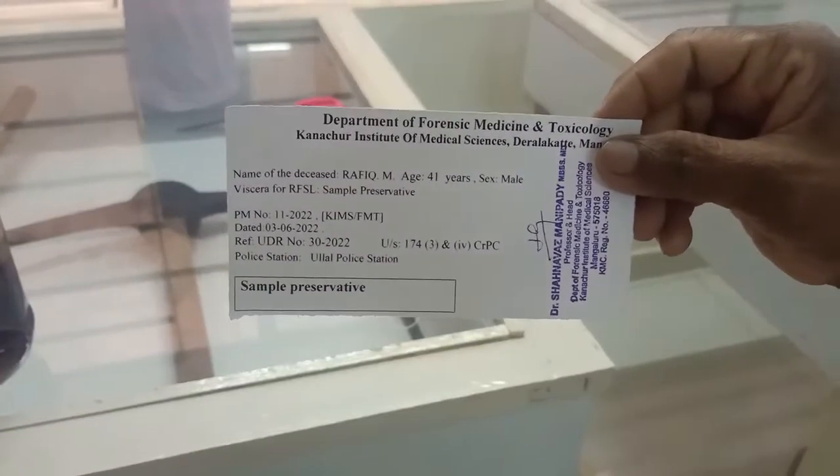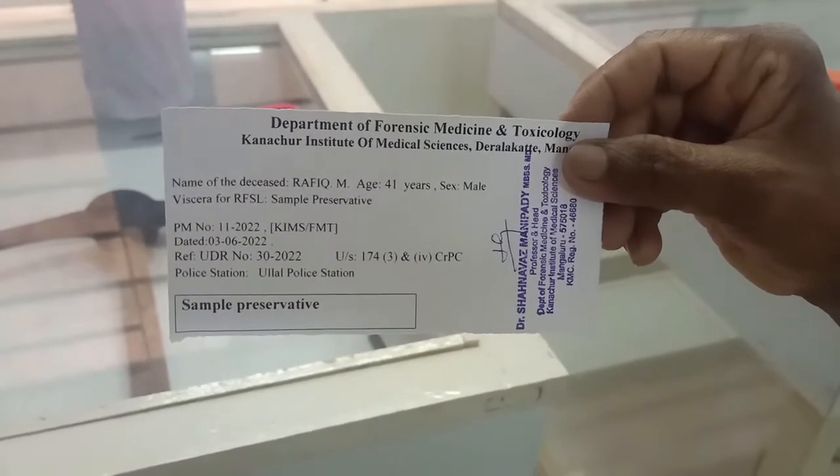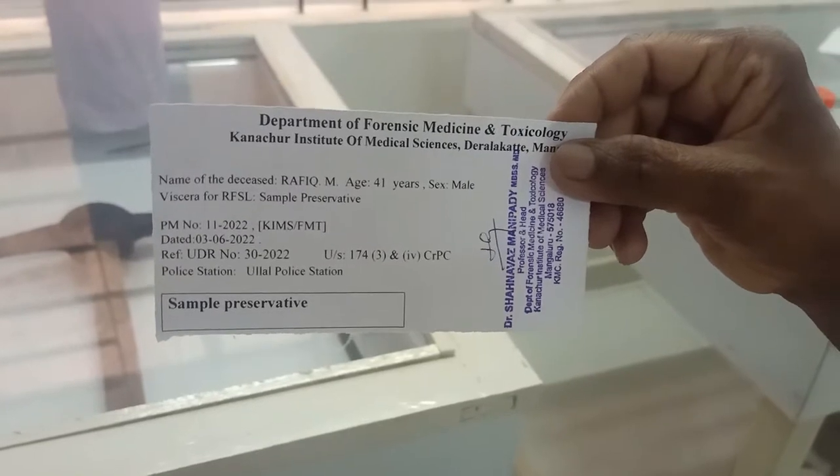This is the label for bottle number four, which contains the sample preservative — saturated sodium chloride solution — used in a routine case of poison.